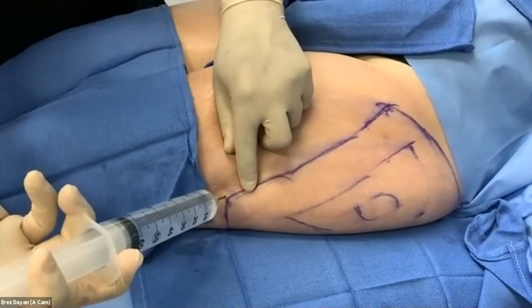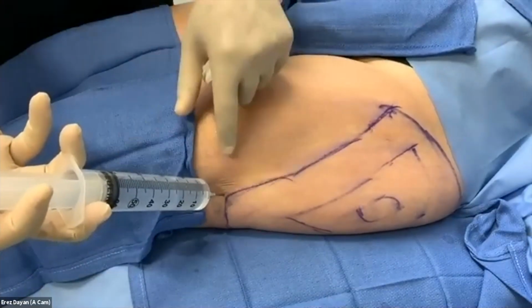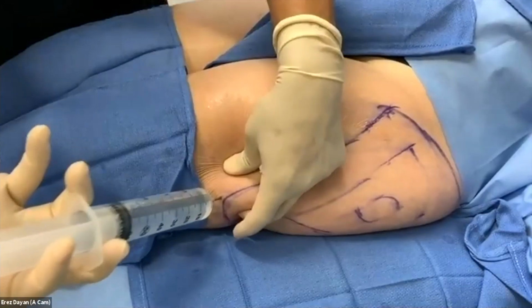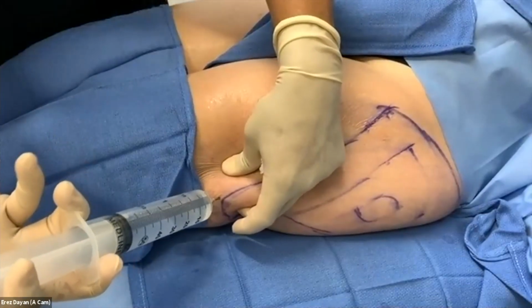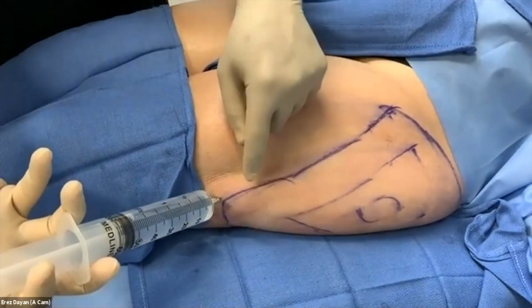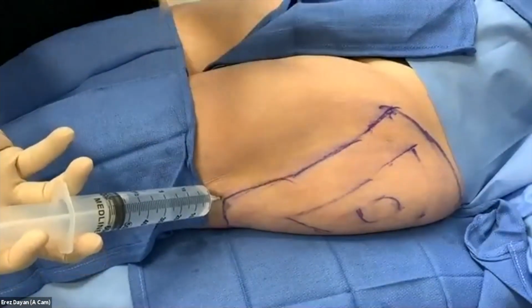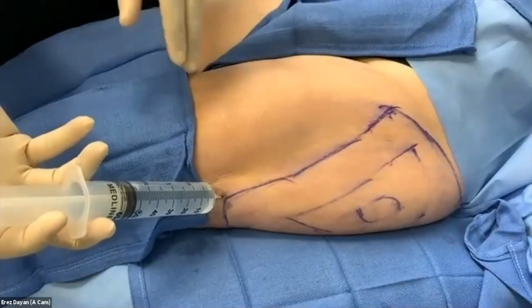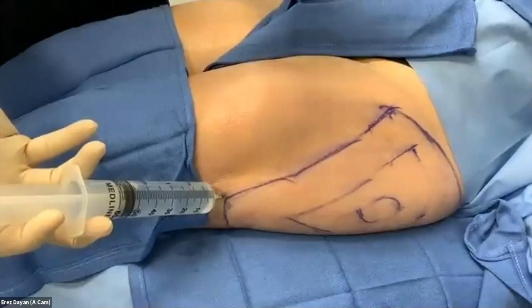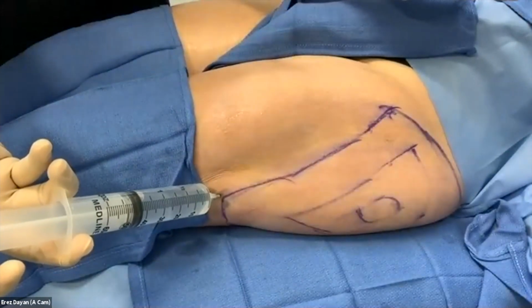You feeling that very much? Good. So she's totally good. Now, you don't want to see this peau d'orange kind of appearance because that indicates that you're pretty superficial. I kind of want to be right above the fascia, and if you hit fascia, they'll tell you. You may not have seen that, but you'll see the video: just now I felt resistance, and as soon as I get above the fascia, there's a plane. And the fluid just flows in much more easily. So here I'm in that plane, and you see how easily it's going. I'm barely pushing on it.